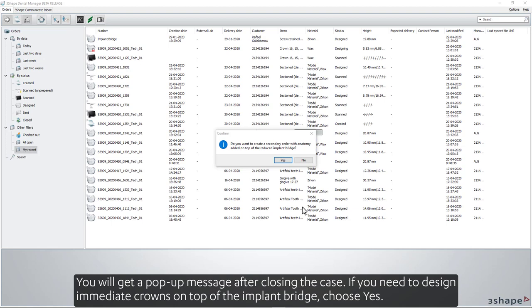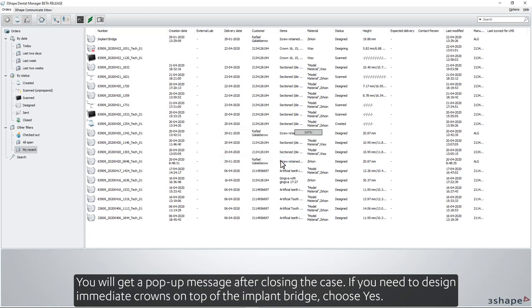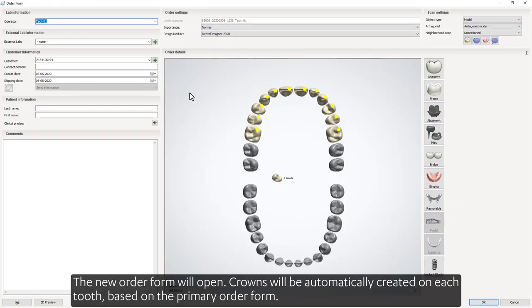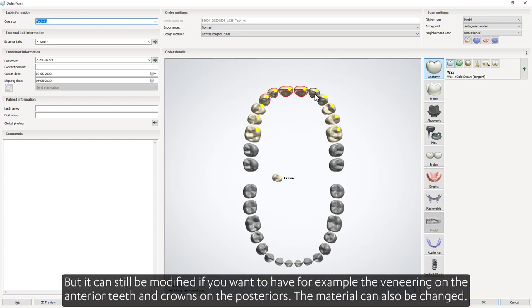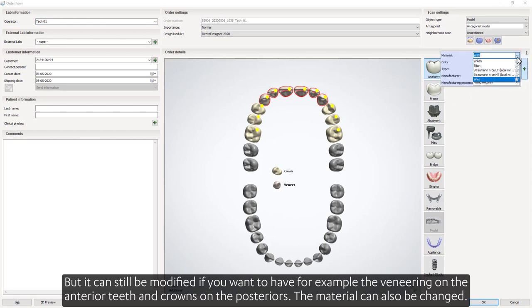You will get a pop-up message after closing the case. If you need to design immediate crowns on top of the implant bridge, choose Yes. A new order form will appear. Crowns will be automatically created on each tooth based on the primary order form, but it can still be modified — for example, to have veneering on the anterior teeth and crowns on the posteriors. The material can also be changed.